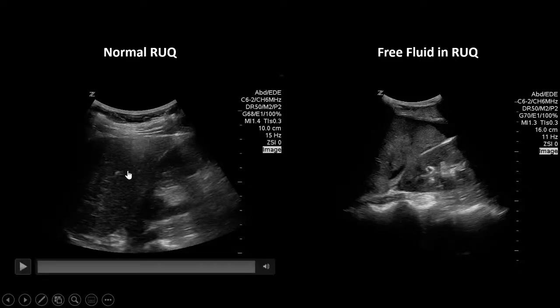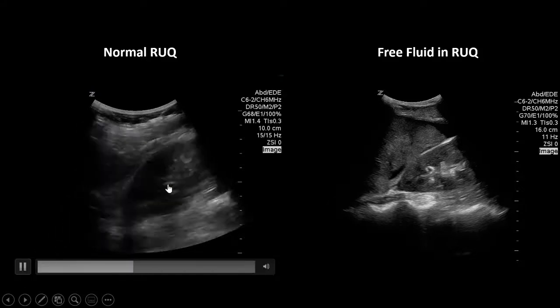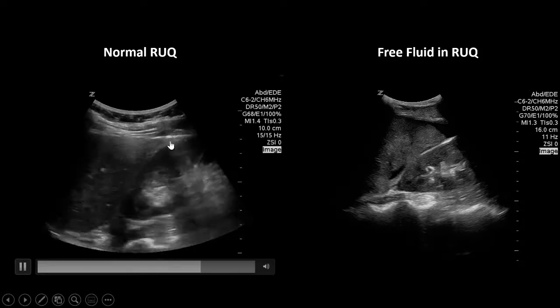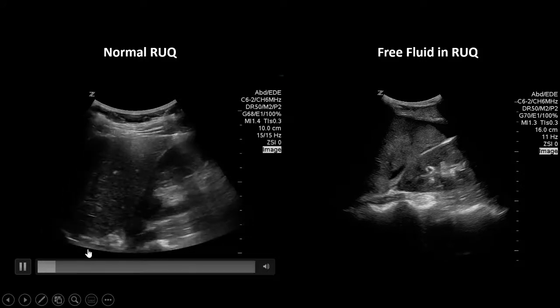This is what a normal right upper quadrant scan looks like. Here is the liver, and here is the kidney - one of the easiest organs to see in the belly because it has a double density: the inside appears white on ultrasound and the outside appears black. Here's the caudal tip of the liver with its triangular shape. The operator sweeps until the kidney disappears on each side, looking at the interface between the kidney and the liver for any blood. In this case there's no blood between the kidney and the liver.